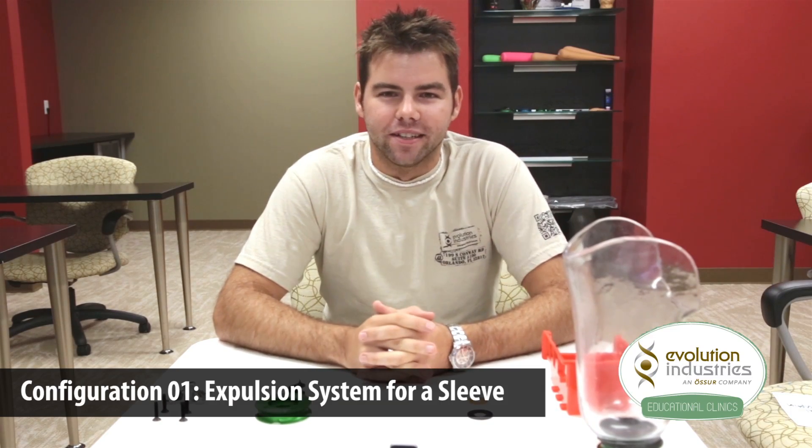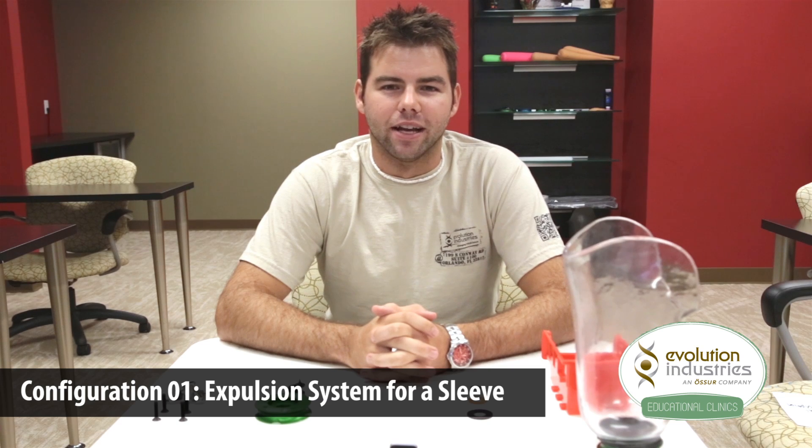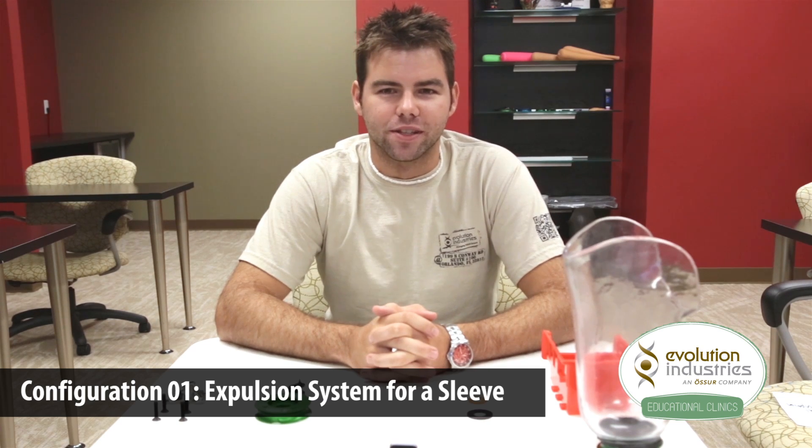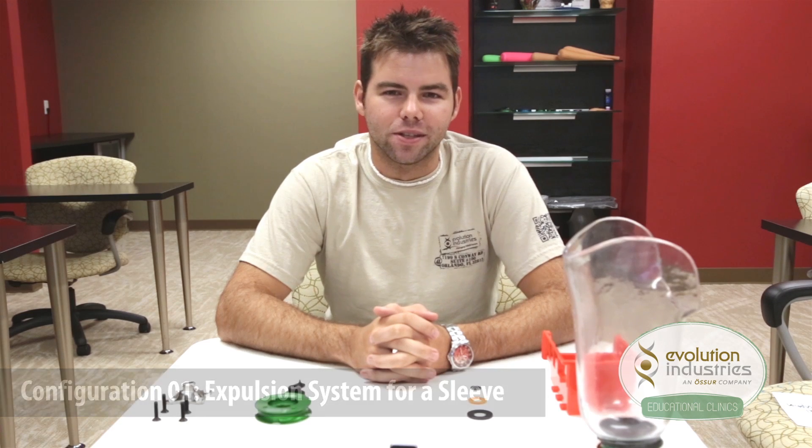Hi, I'm Jeremy and I work in customer service here at Evolution Industries. This is an instruction video on how to set up Evolution's expulsion system for use with the suspension sleeve. This simple and reliable system uses a one-way expulsion valve concealed distally in the valve plate for a smooth finish. This differs from other expulsion systems where valves are installed on the socket where they can be damaged.